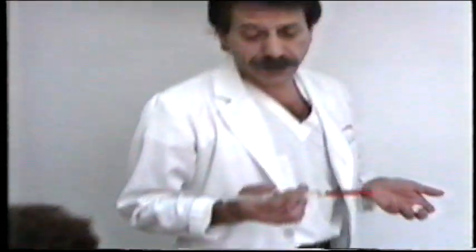I would like to tell that this is the second session of addressing the cervical facet joints. During the first session, the same structures were addressed, and the patient initially was presenting with radiculopathy in distribution of the C6 dermatome.